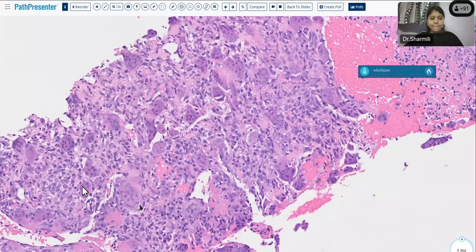When I put it on the chat box, giant cell rich osteosarcoma here, that's what I was worried about, whoever that was. So G34W, it's an H3.3, so it's a histone modification. Sorry, go ahead, Manish. Yeah, so for GCT, sir, the rule is GCT must be subchondral. So the location of a giant cell tumor of bone doesn't fit, and this is not subchondral.